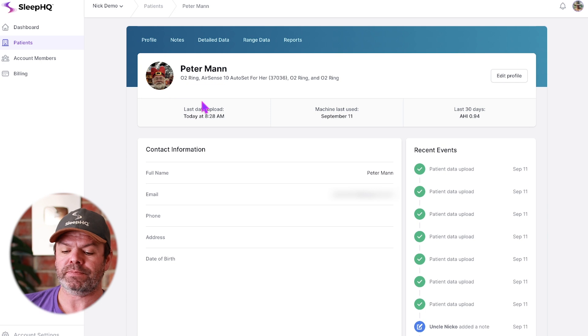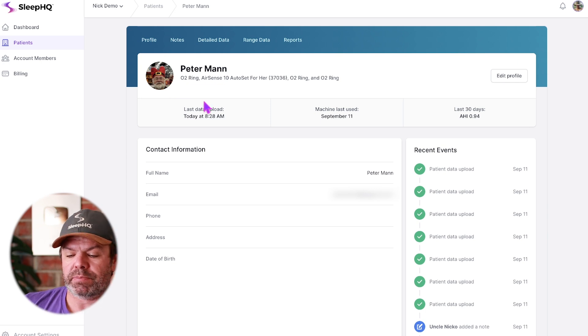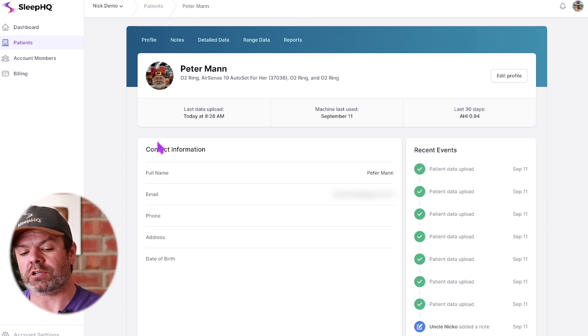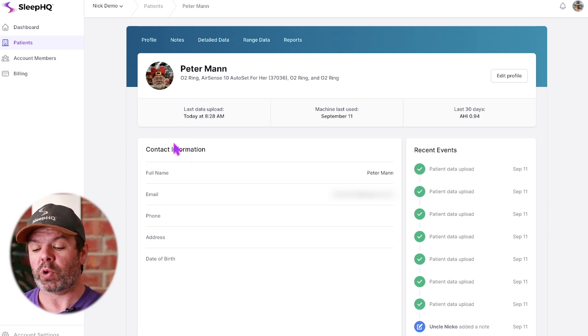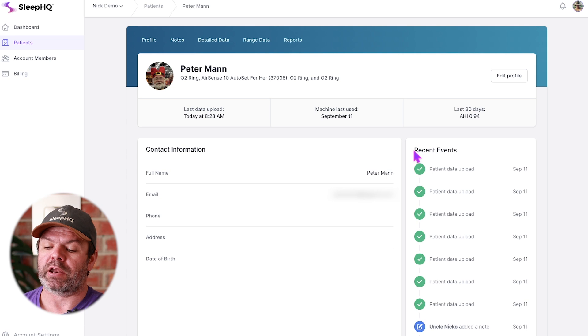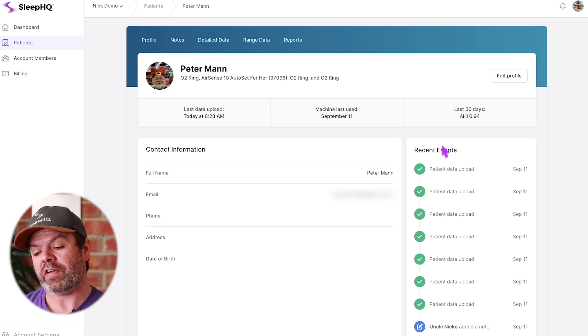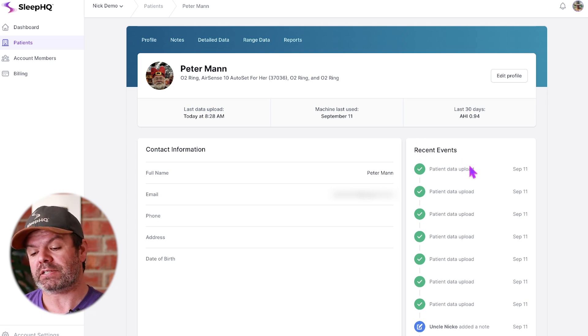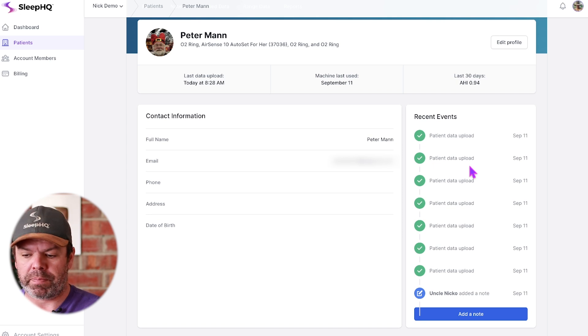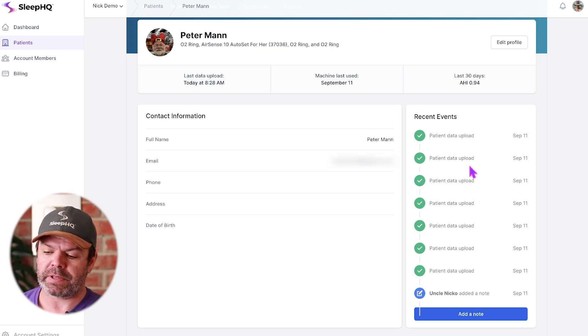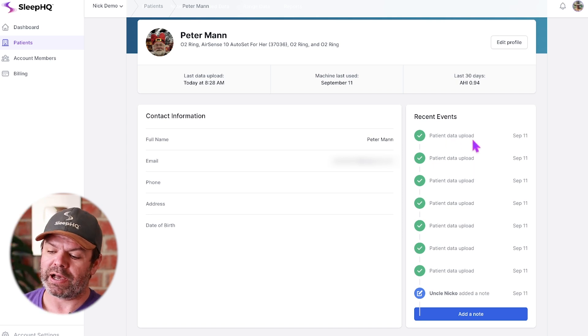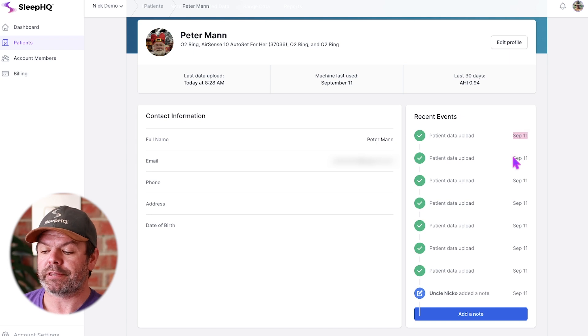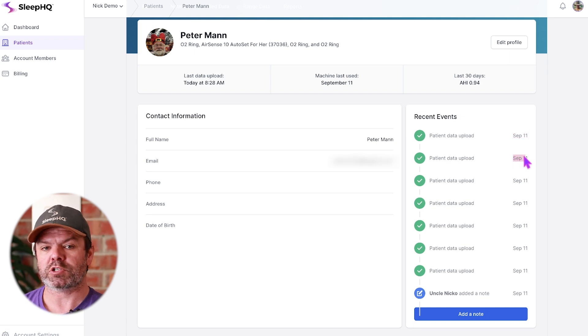This is the profile page here. We've got his contact information that we can edit, and it also has recent events over here on the right-hand side. This is the most recent uploads that Peter has done.